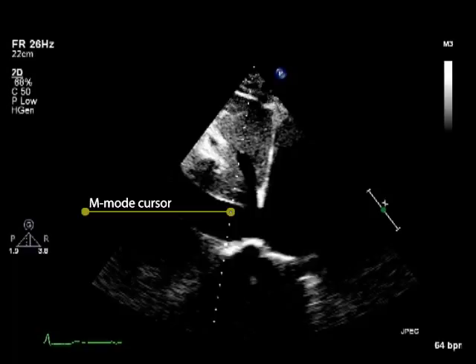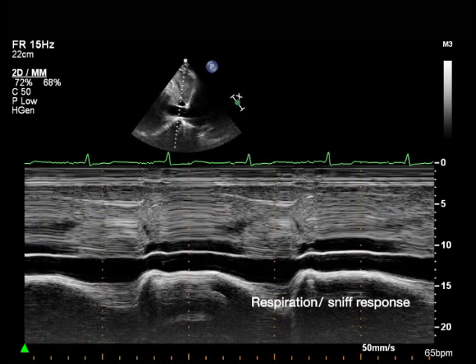When there is no response in the vena cava diameter with normal respiration, the patient is asked to sniff. This generates a sudden decrease in intrathoracic pressure, which normally results in a decrease in inferior vena cava diameter.